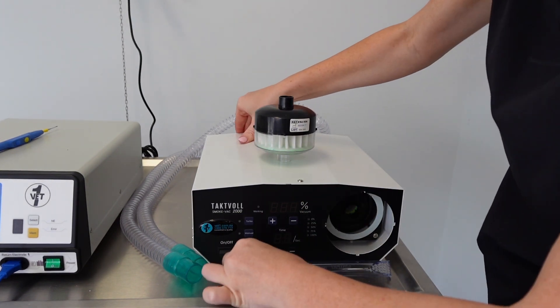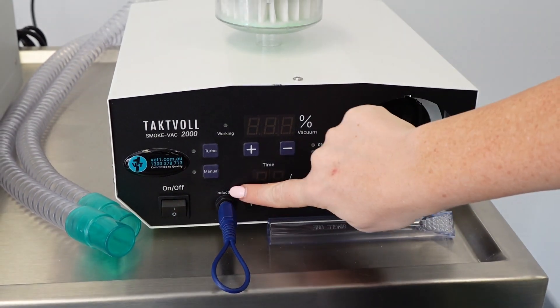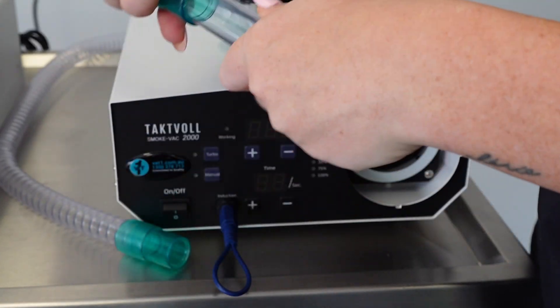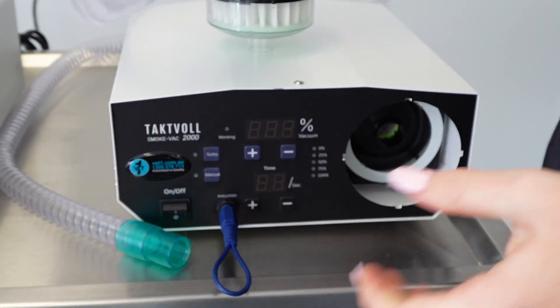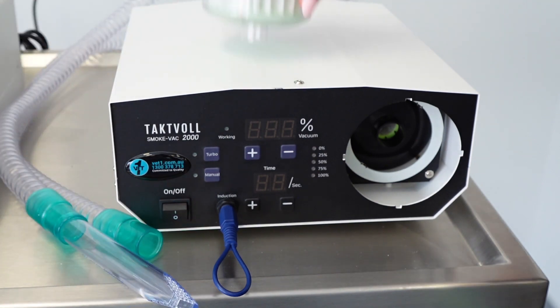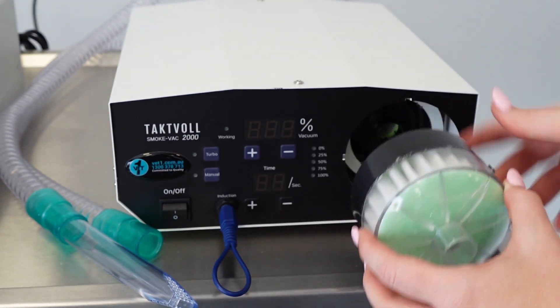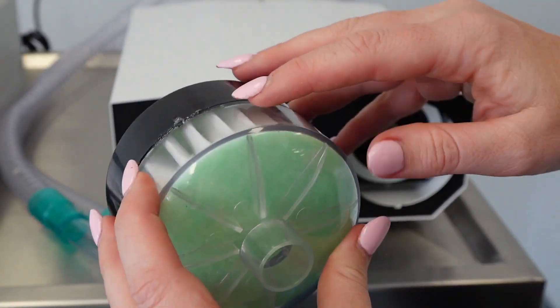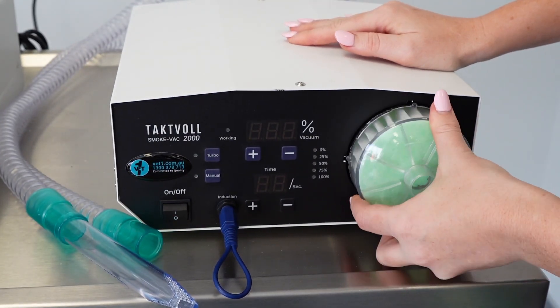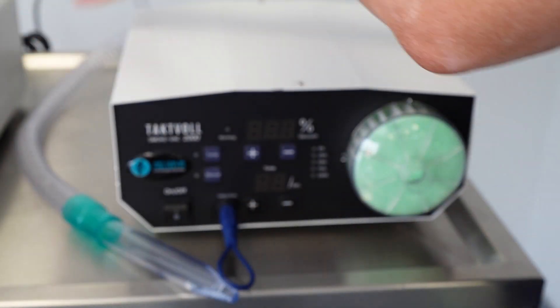Attach your suction wand to your tubing. Then you've got your filter — the black always goes to black, so the green will face outwards. The filter has little nodules that line up on the machine, so make sure they are all lined up before inserting it nice and snug. Then you can attach your tubing onto the front of the filter.